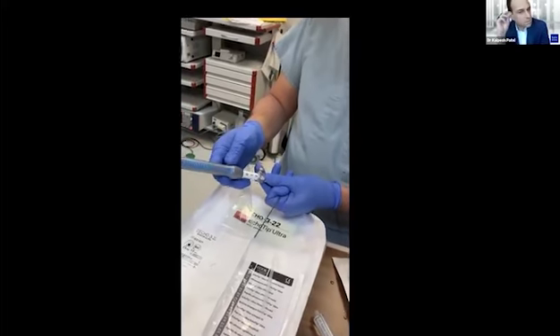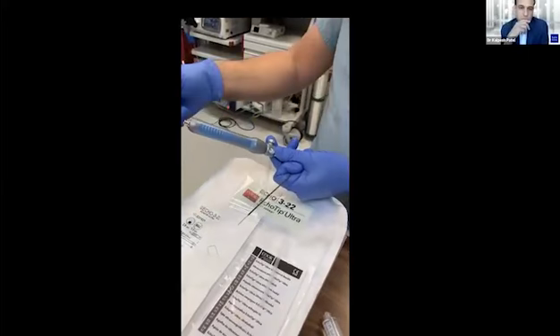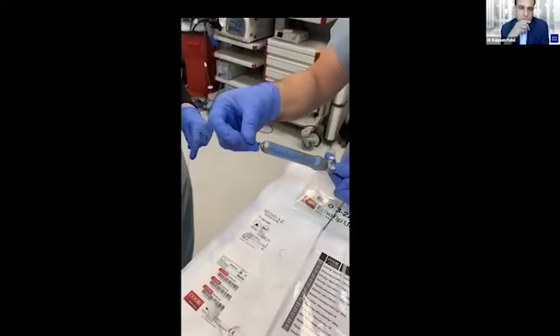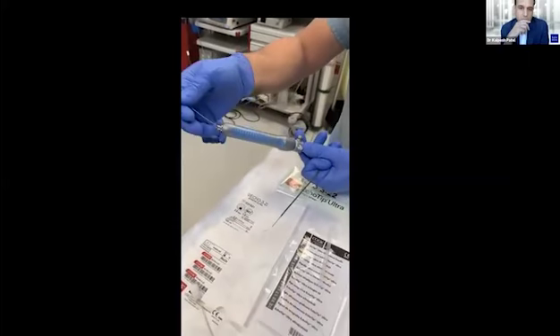So imagine that the needle is inside the varix. And now using the stylet that came with the needle, we're going to push out the coil. And if you can take a close look there at the needle tip. So first we're seeing the saline being expressed from the needle.